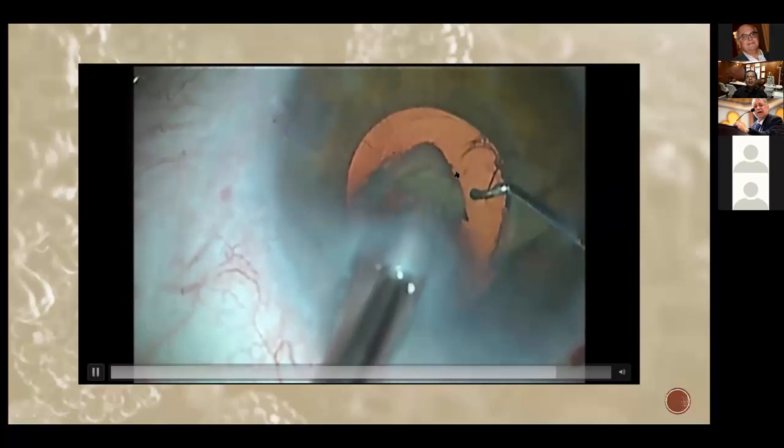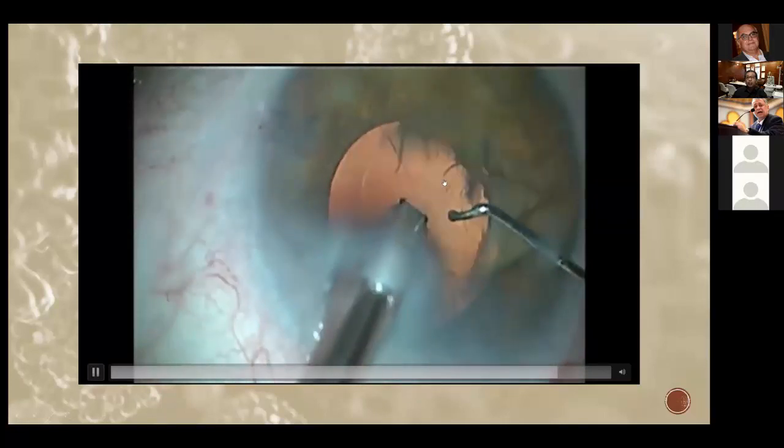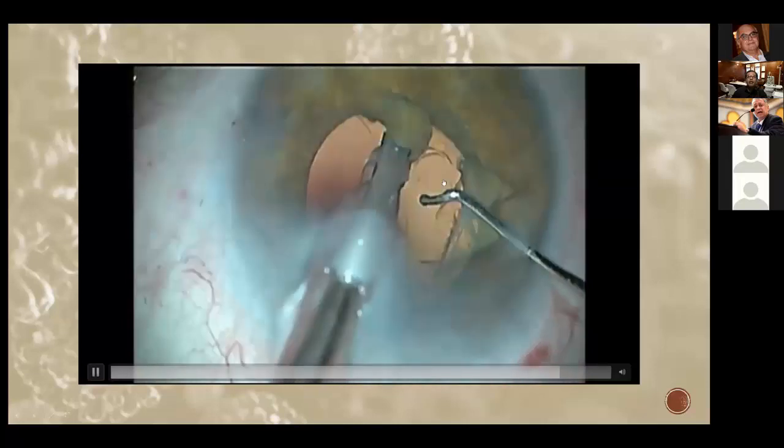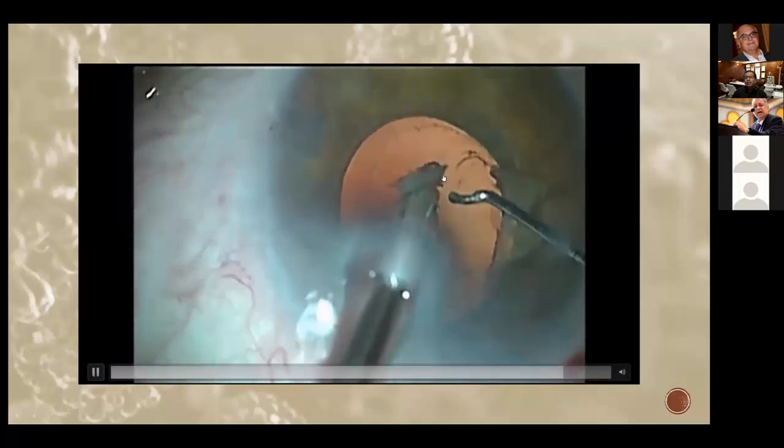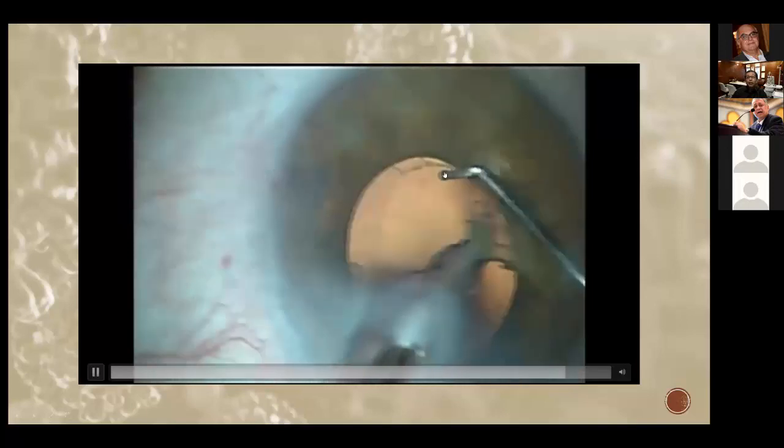Spider legs again. Web. Oh, or webs, yes. Sorry, it was spider web or spider legs. And still the posterior capsule is intact. How do we achieve this?